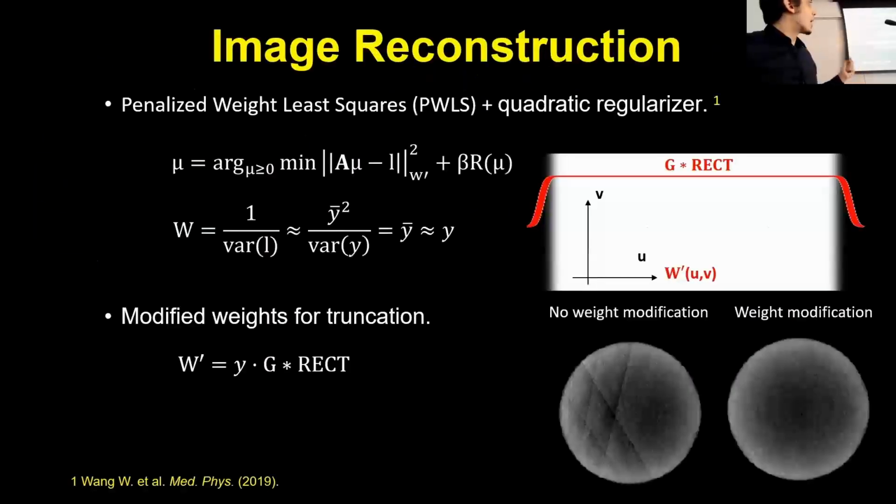Okay, so here, one of the problems we are facing is related to the truncation artifacts that we are going to see for some of the views. For that reason, we proposed a modification of the weights to try to minimize that problem. Very good, because in terms of hardware, you try all kinds of combinations. Maybe the reconstruction algorithm part, maybe other things, you can take a look.